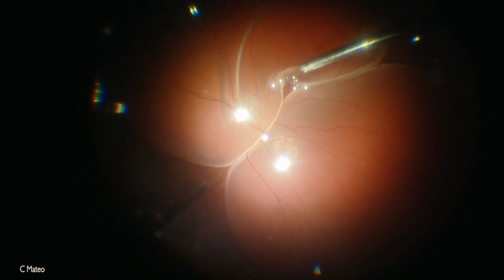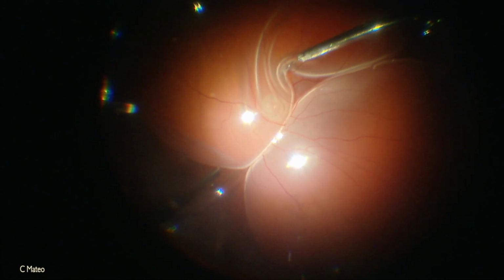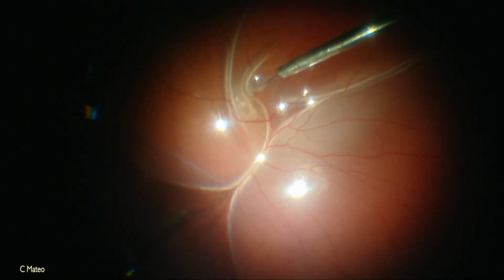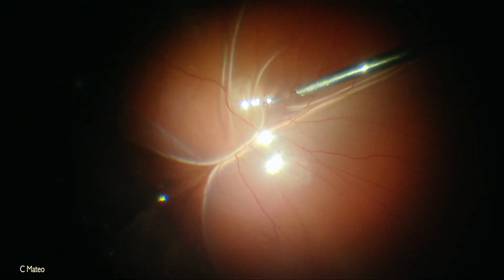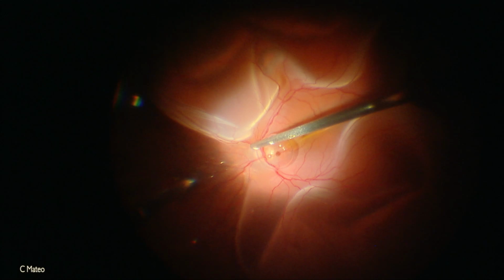This is, in my opinion, the most dangerous maneuver in this surgery. Be very gentle to avoid excessive pressure on the retina that could cause a break. Again, air fluid exchange to confirm that the fovea is detached and mobile. We inject perfluorocarbon liquid, reattaching the retina.